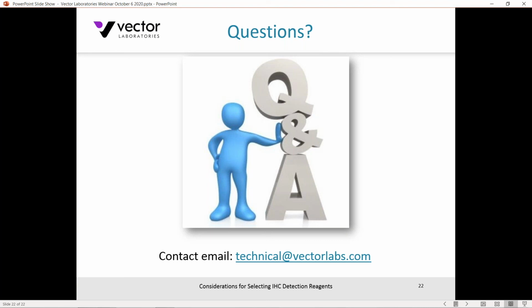Indeed, what you could do then would be to choose a non-avidin-biotin based system, such as a polymer based system, the ImmPRESS reagents I showed earlier on, as a comprehensive kit format, that don't have a biotin or avidin component in them, and therefore there wouldn't be a concern for those reagents detecting biotin in those tissues, and certainly equivalence in terms of sensitivity in a lot of cases. So it depends a little bit on the tissue type you're looking at and maybe the scope of the project.